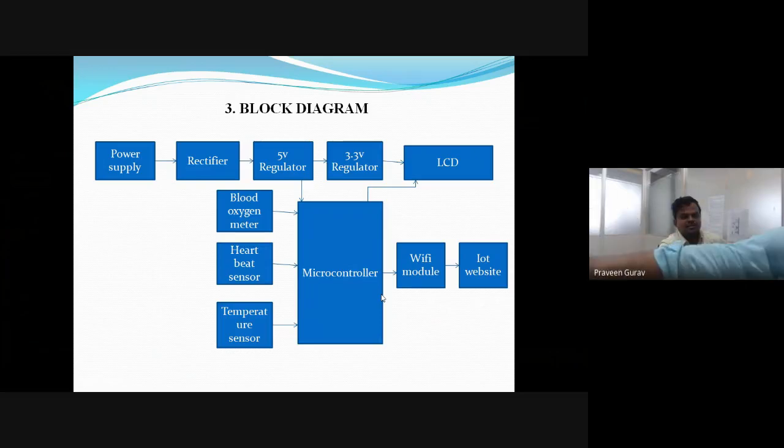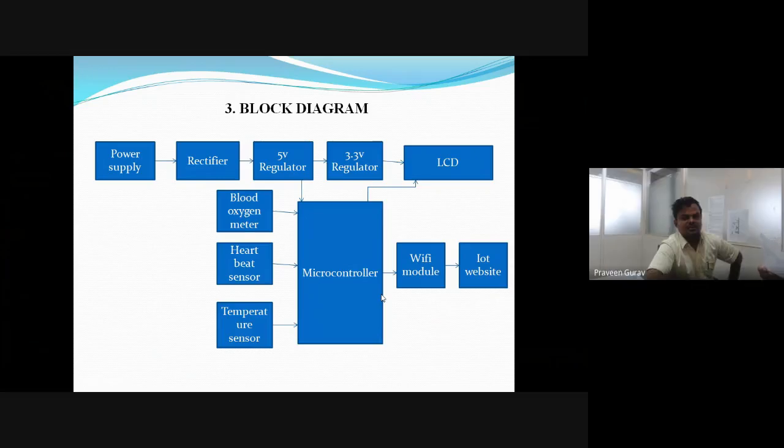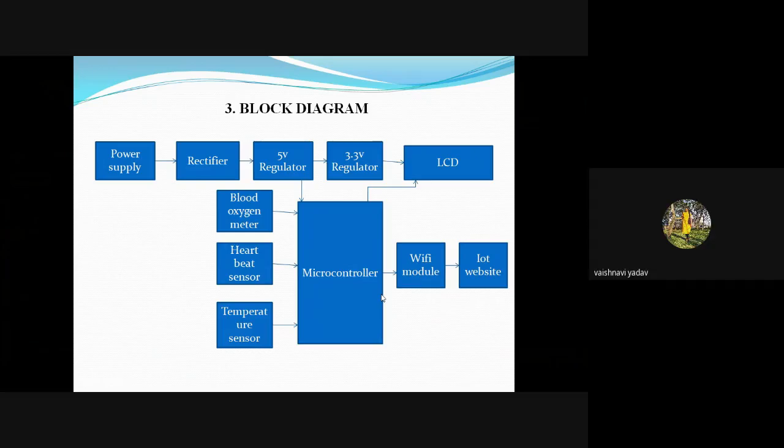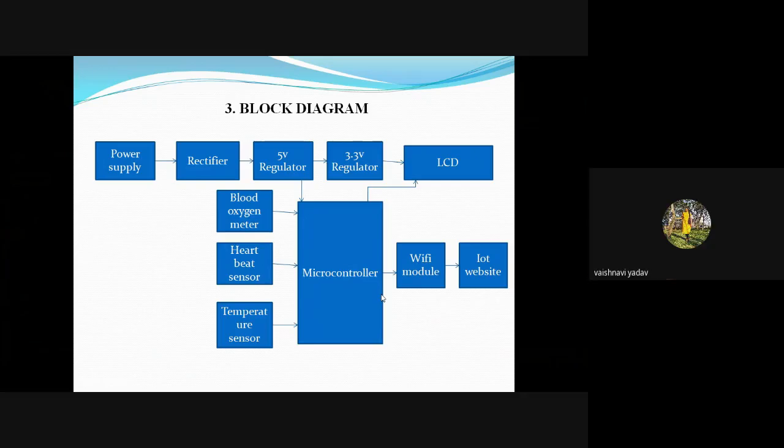Can you say what is the unit for the blood oxygen meter? So this much of a unit is required for a healthy person. Yes, like that, sir.